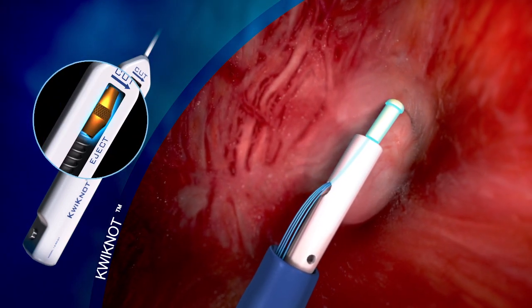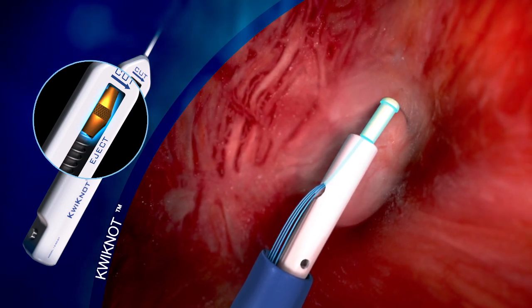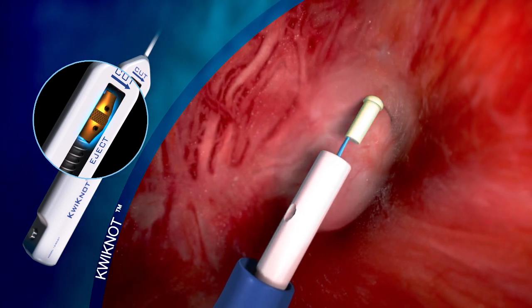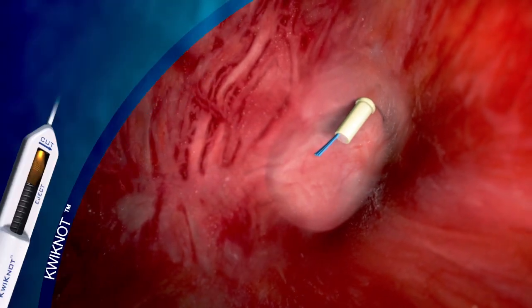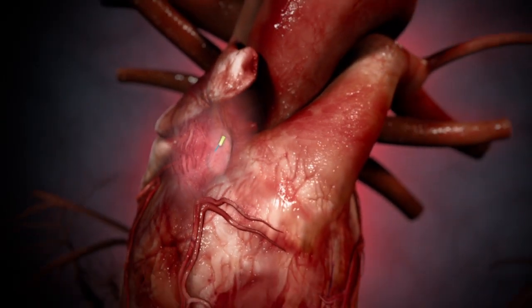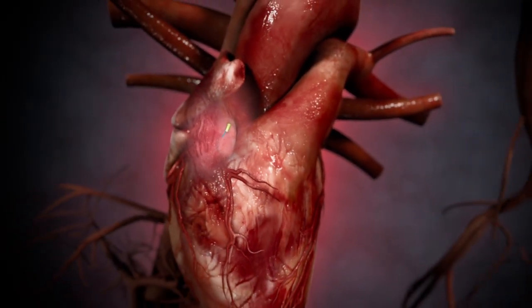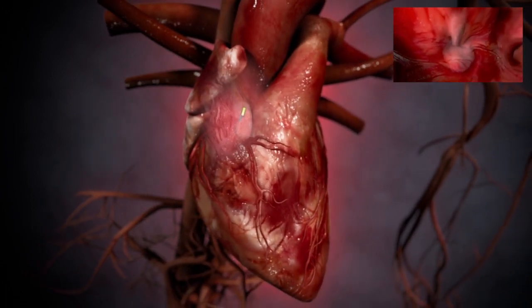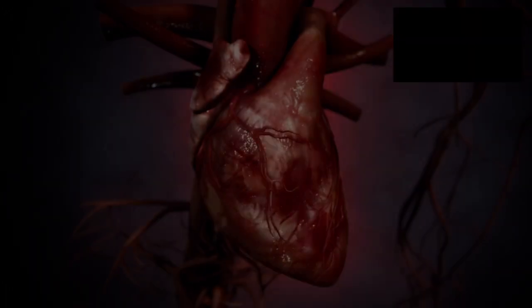Advancing the gold knob forward ejects the knot, and then rotation cuts the suture. The quick knot is then removed, the sheath removed, and the PFO tunnel is now completely closed, leaving only the polypropylene knot in the right atrium and nothing in the left atrium.